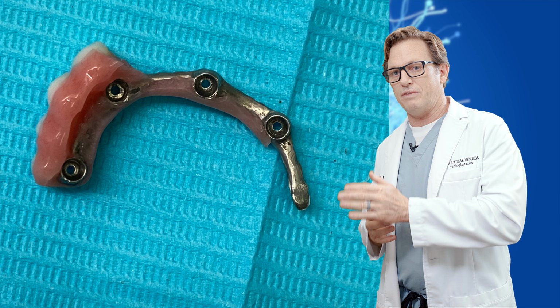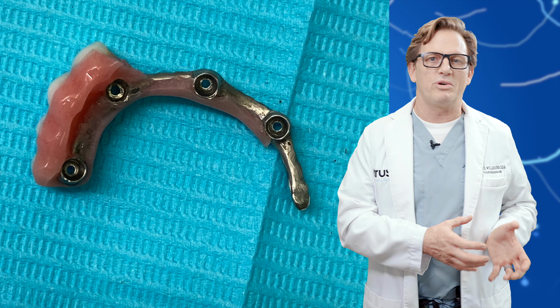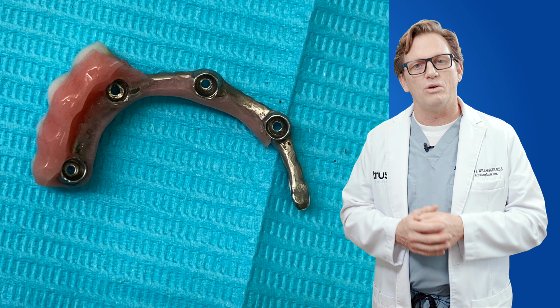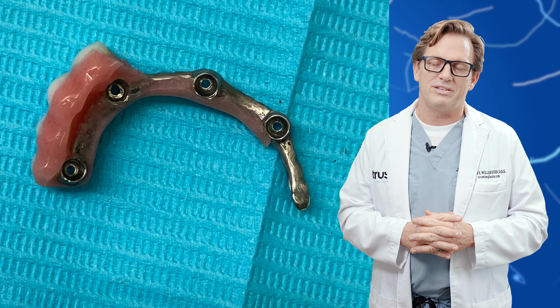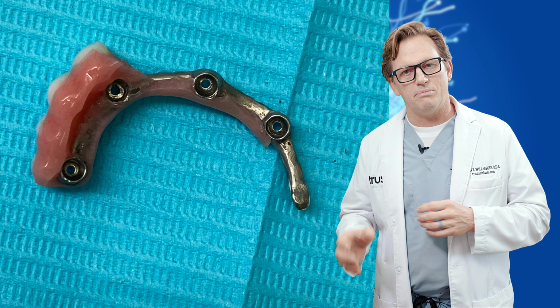They stay away from the first and second molars, and they don't include those molars in the bridge or in the prosthesis, which is crazy because we need those molars. It puts so much load on our front teeth when we don't have the support in the back of the jaw. Again, this is why I do not like the all-on-4 procedure, because biomechanically it simply does not make sense.